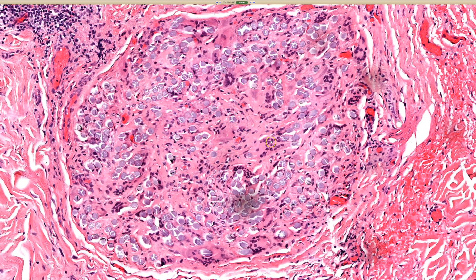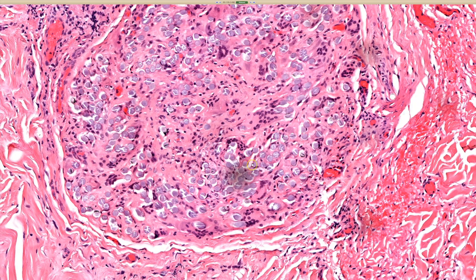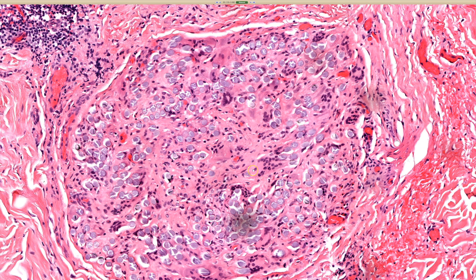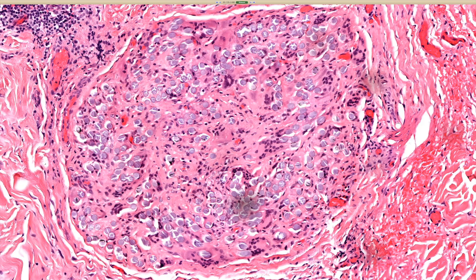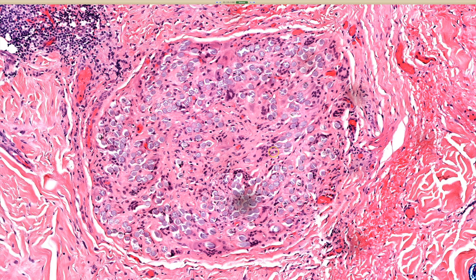And this is good for suture granuloma. And so there's lots of different types of suture. Some is dissolvable, and we don't see very often, and some is more permanent. But this is a braided synthetic suture, and if you were to use polarized light to look at this, usually this will be very birefringent and brightly polarizable, and sometimes that's kind of a rainbow appearance.